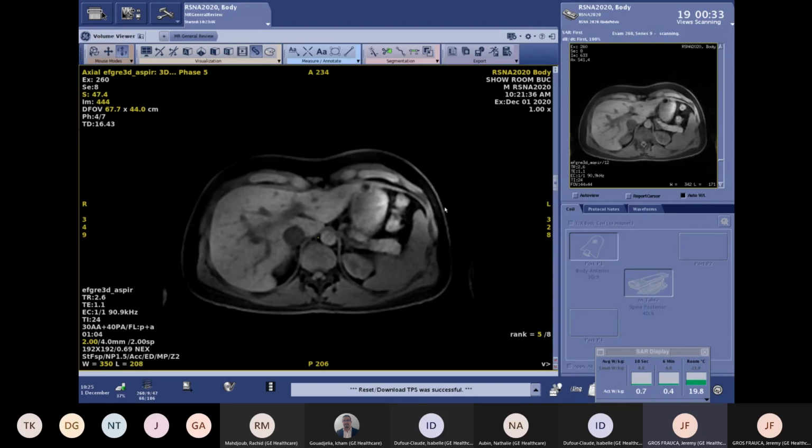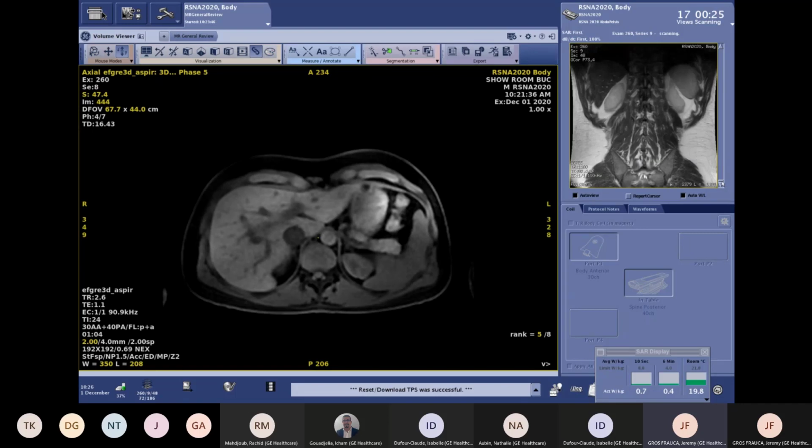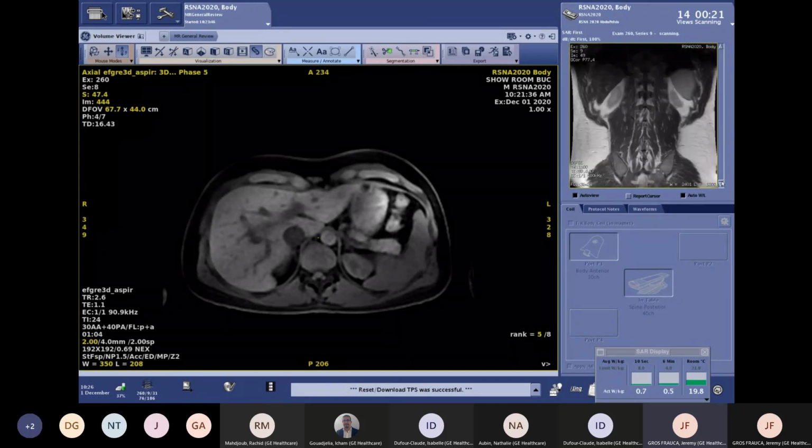Maybe Rashid, while we are finishing the last sequence, do you have any question in the chat box? No, for the moment we don't have any question. You can continue if you want to present all these possibilities with the Lava acquisition.